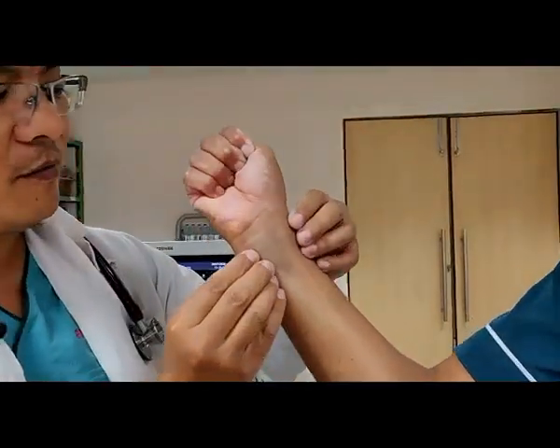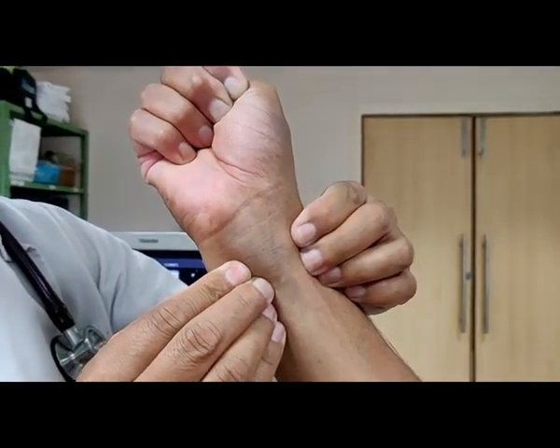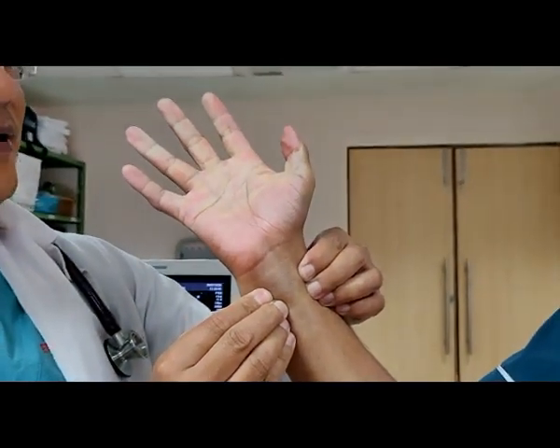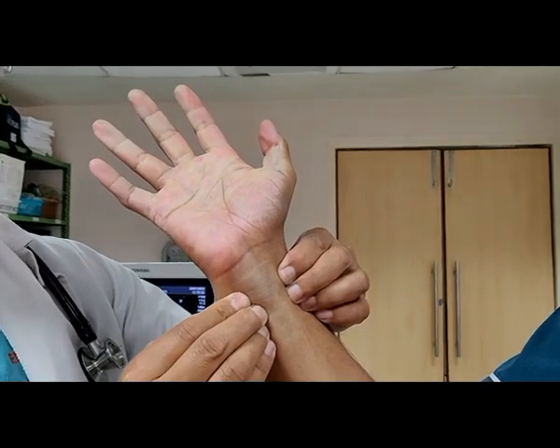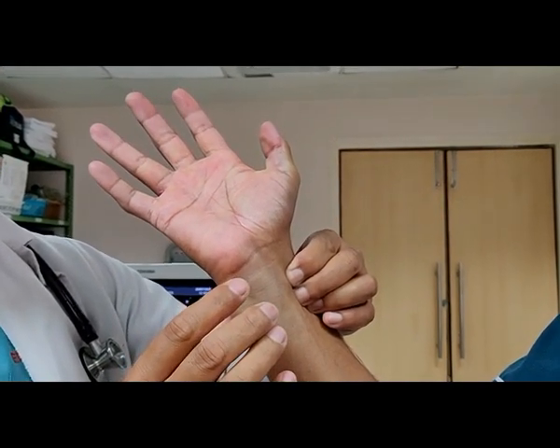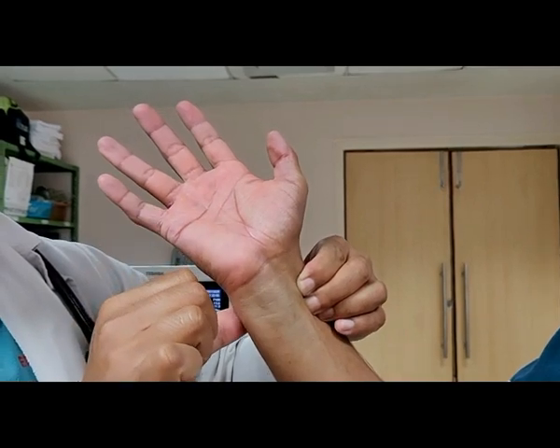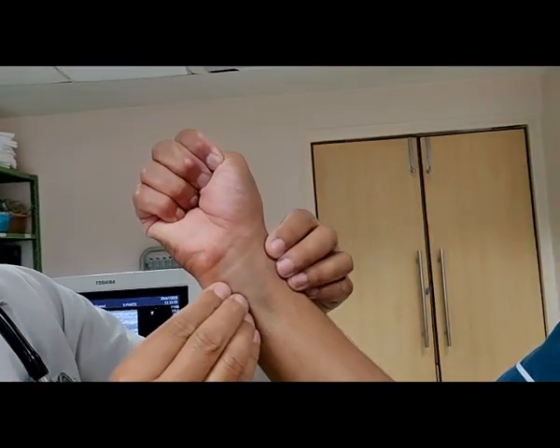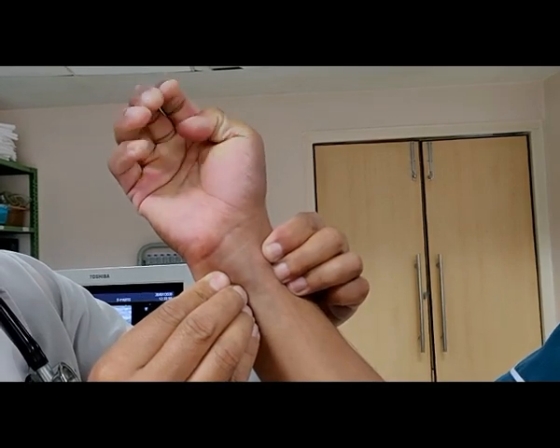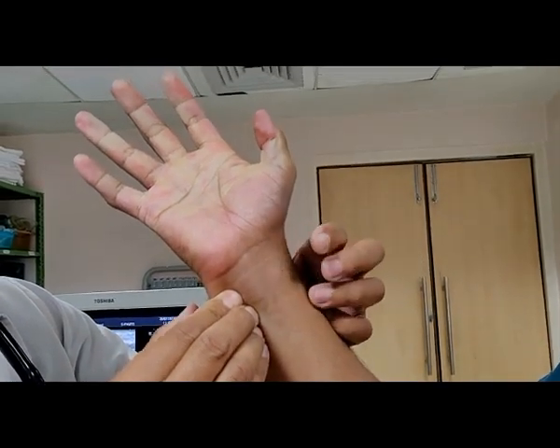We have to squeeze both of them and release. You can look at this as pale. First we have to release the ulnar artery, and you can see the flow on release. Now we are releasing the radial artery.